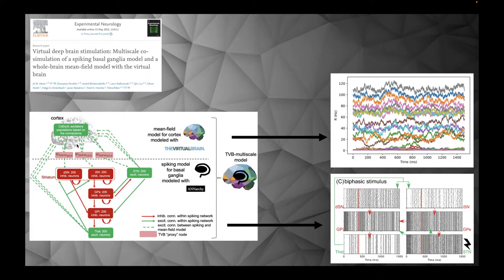So these parameters were, in our study, kind of set. We only tuned these parameters, these interface factors, because the two scales still need to talk to each other in a realistic way, so that we don't have overexcitation here, but we drive this network in a realistic manner. I didn't want to go into too much detail here on how we exactly build up this network.